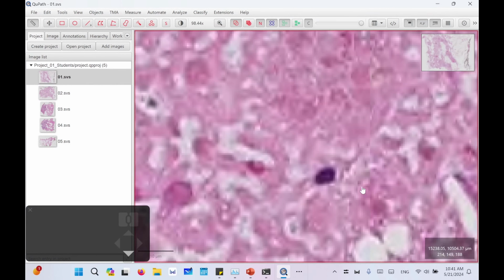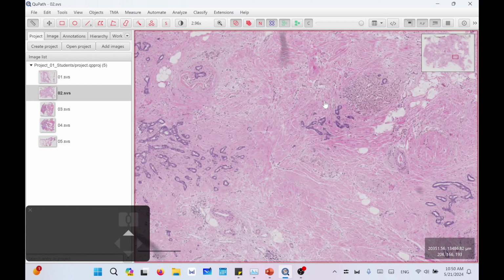The next step, we need to perform manual annotation, and the usage of manual annotation here, as mentioned in the previous lecture, we can use these manual annotations from us or from a clinician or a doctor to provide to a model that can later learn how to automatically segment or annotate the regions.